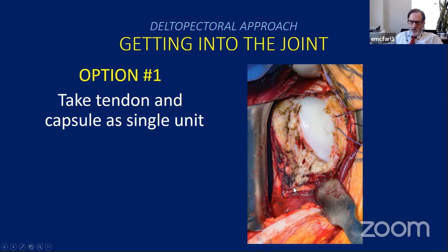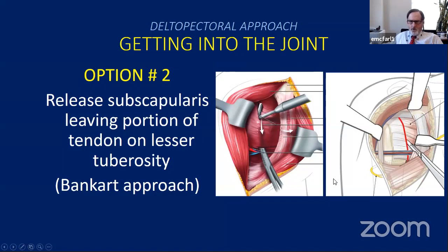You can come down onto the head neck junction here, and you want to release directly on bone. Oftentimes there's some large osteophytes here. I tend not to use sharp retractors. I tend to use smooth Homan retractors down here, because the axillary nerve and the vessels are all down that way. And so you want to try to avoid using sharp retractors down in this area where you might find the nerves.